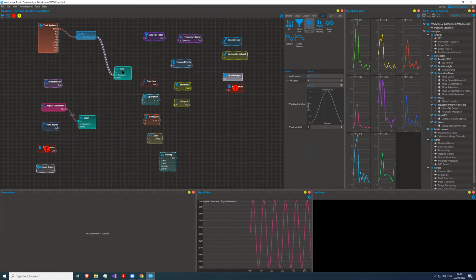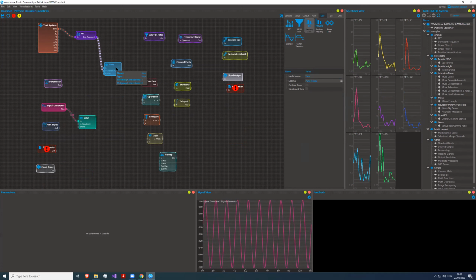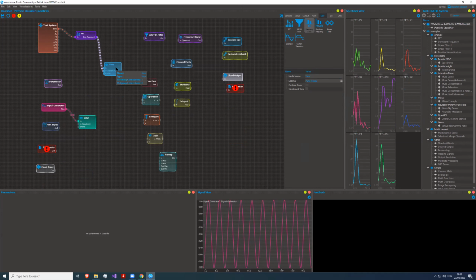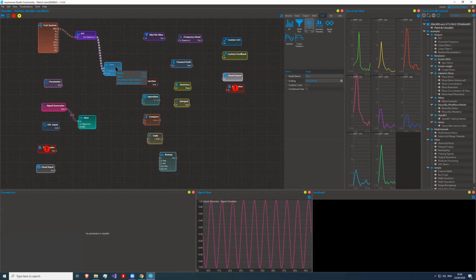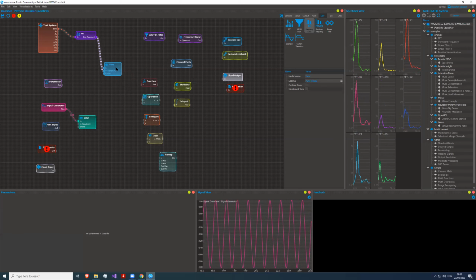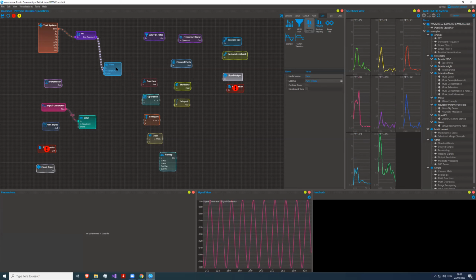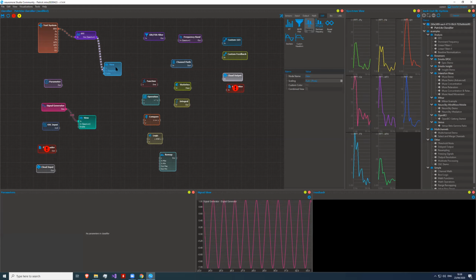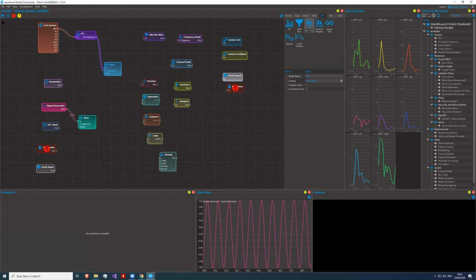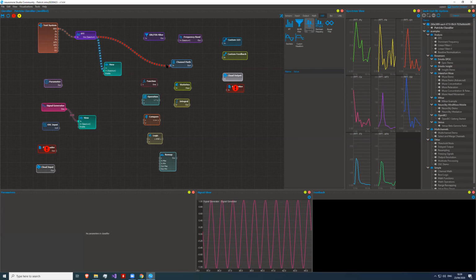And the beauty of that visual programming is that it's very simple on the one hand, but under the hood, all those operations, no matter if it's the FFT, any kind of filter, or any mathematical operation, are being done by the neuromore system and by the neuromore engine, and the neuromore engine is being initialized with that classifier. So it runs highly optimized, like Andy said, on device. And every moment that you make changes in that classifier, the neuromore engine automatically gets updated.